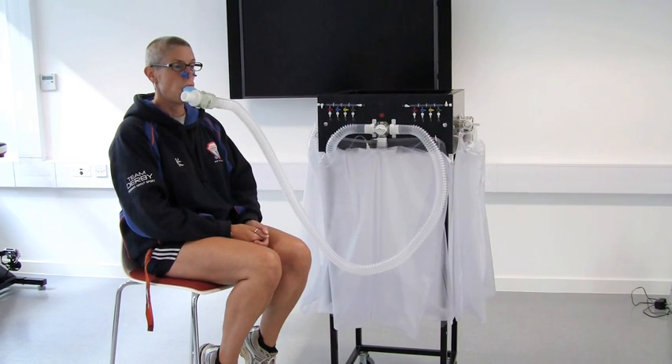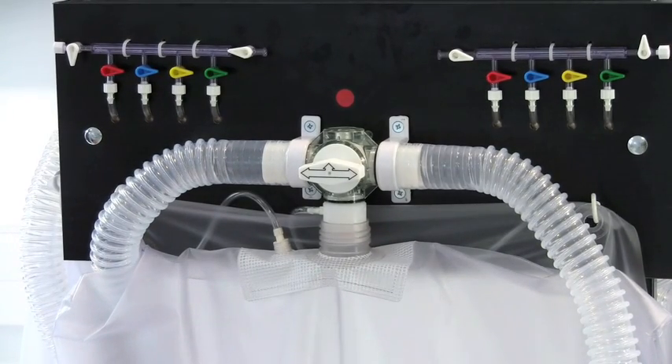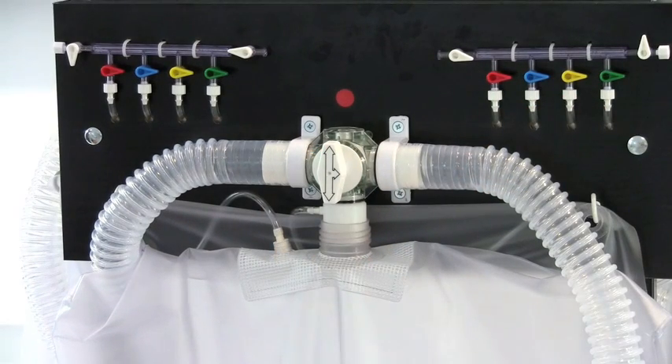Here you can see the full Douglas bag set up: the mouthpiece attached to a two-way non-rebreathing valve and then tubing attached to the Douglas bag. This picture shows that the valve for the Douglas bag is closed, and by opening it we allow air to flow into the bag so the expired air sample can be collected.